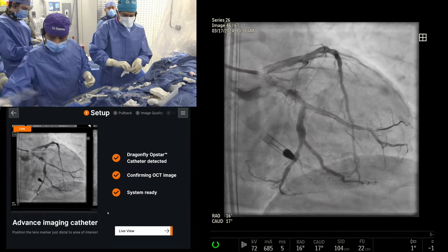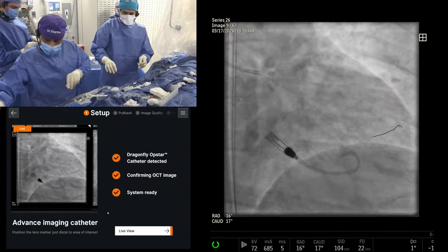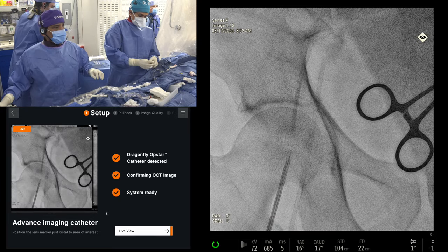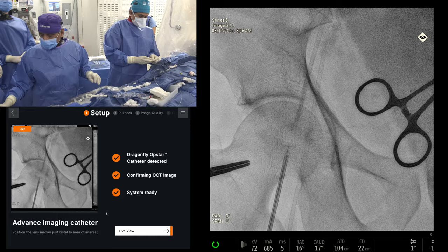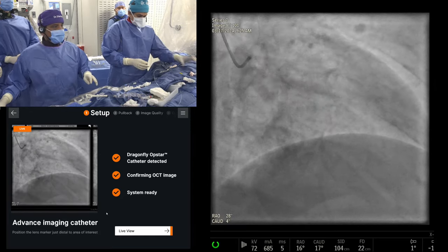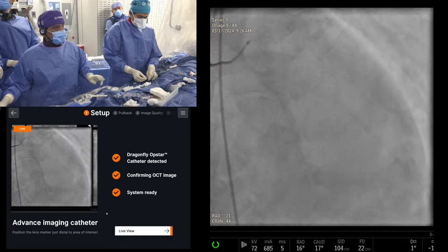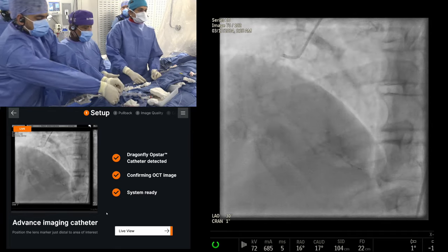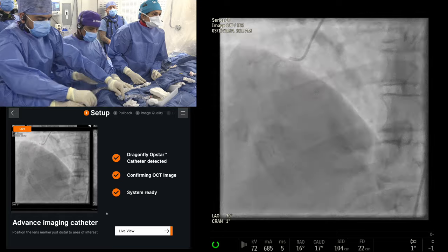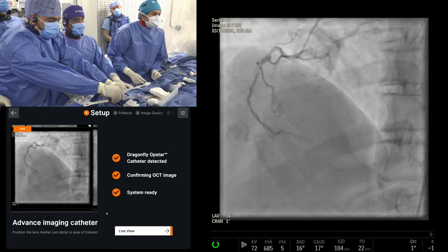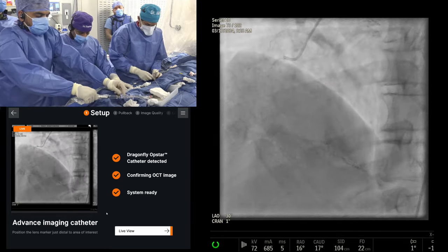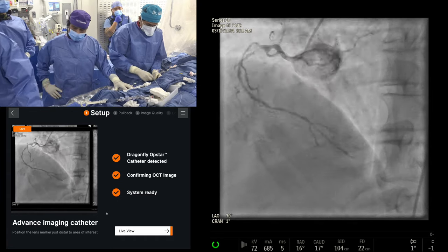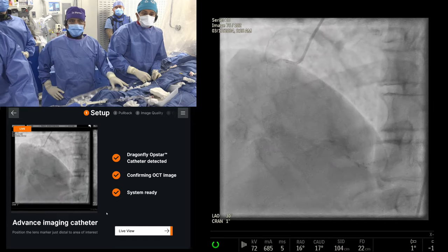One more OCT. What do we decide about the right coronary? We've hit our dye threshold. We'll leave the RCA — there's a lot of disease there. In these cases, we often bring patients back in three months. Let the other vessels heal nicely, then complete the job — RCA is still there, good size, dominant from PDA point of view, PDA is coming from there. We'll bring this patient back in three months to complete the RCA.